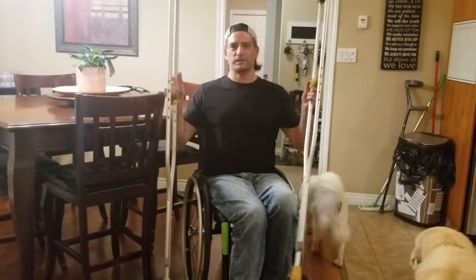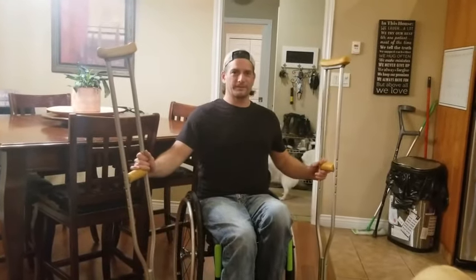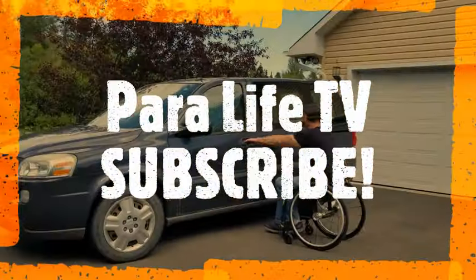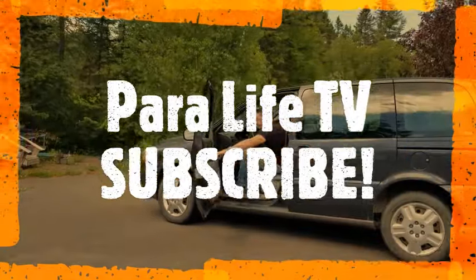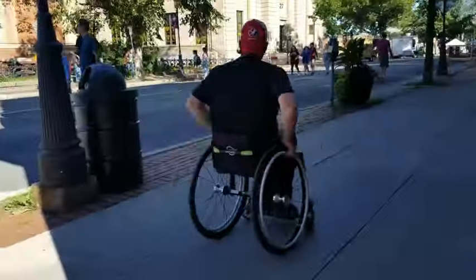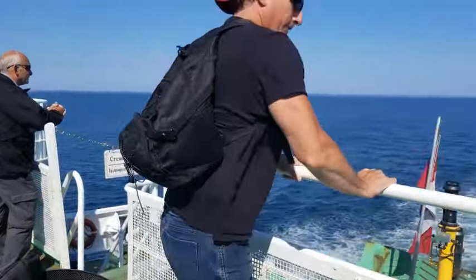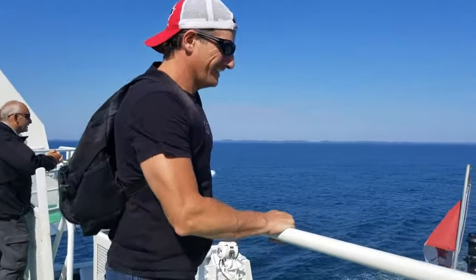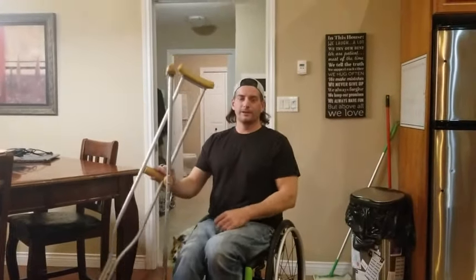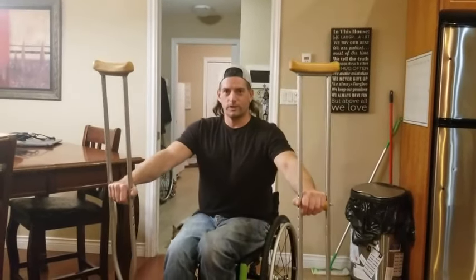Hey everybody, Shane here. Today I'm going to show you how I walk using underarm crutches. So stick around. Welcome back. Like I said, I'm going to show you how I walk using the underarm crutches.